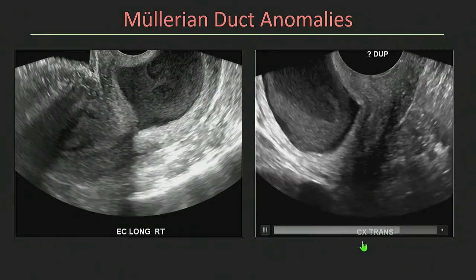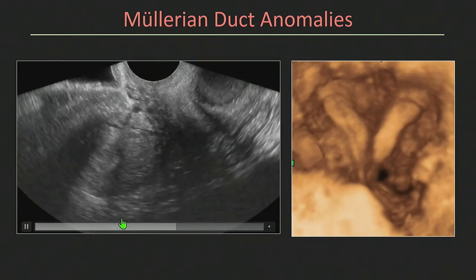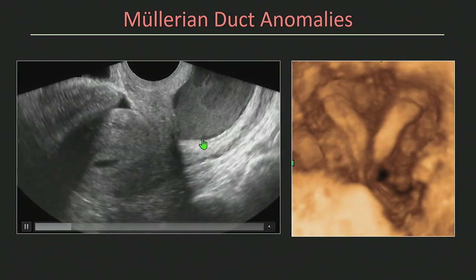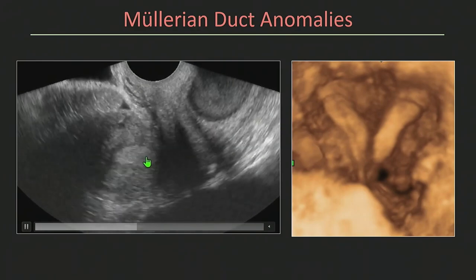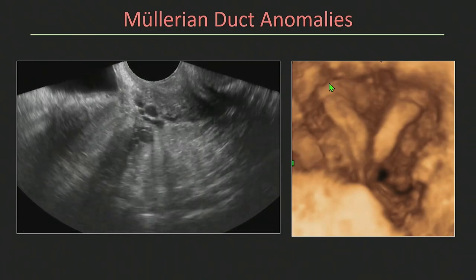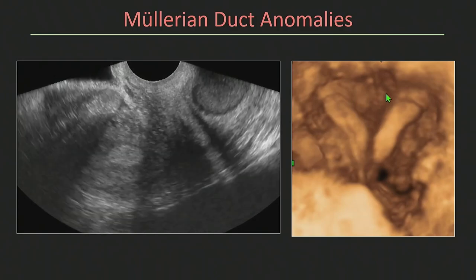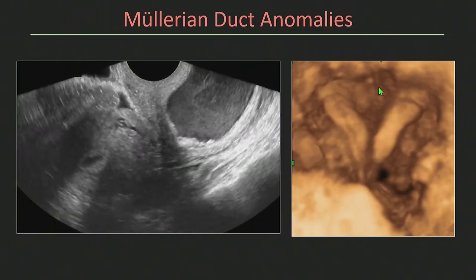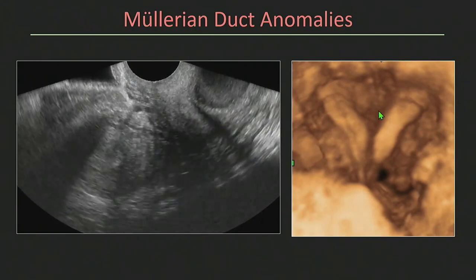You can see that there's probably another cervix here, so they're suspecting duplication of the cervix. On the longitudinal view of the uterus, you might appreciate that there is a split of the endometrial cavities — here's the first cavity, and then the other cavity or horn. On 3D, you can at least appreciate a smooth, flat external uterine contour. There is indentation of the endometrial cavity, probably by a muscular septum and a fibrous septum deeper. This is most compatible with a septate uterus, although not super well demonstrated on this 3D.